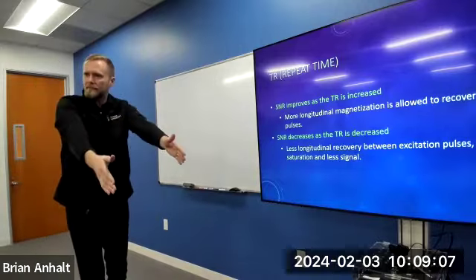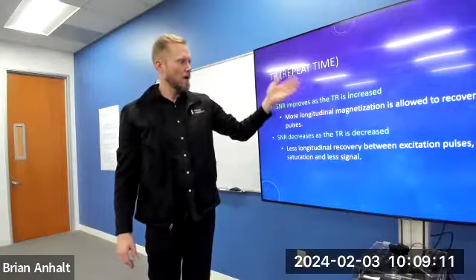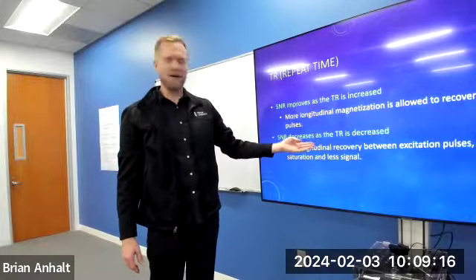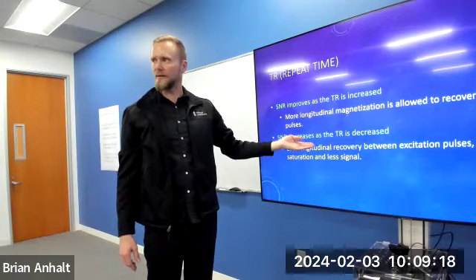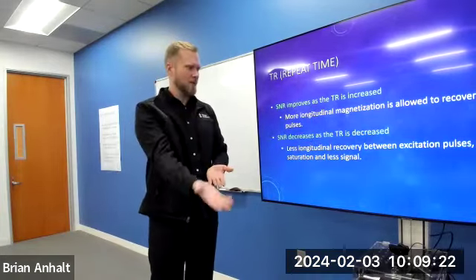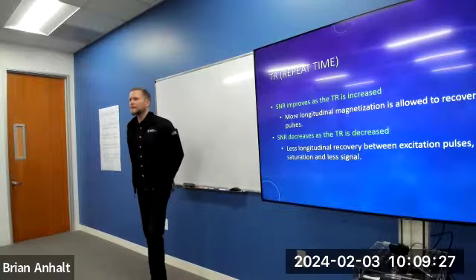We do it again, right? So a longer TR will improve your SNR. On the other hand, a shorter TR will decrease your SNR, right? Because we don't have as much longitudinal magnetization recovery to flip into the transverse plane. Following me?